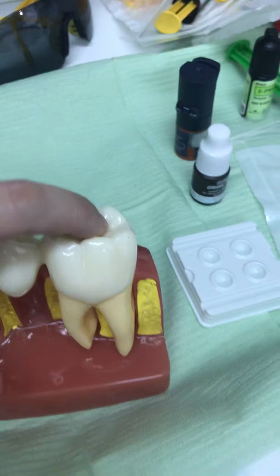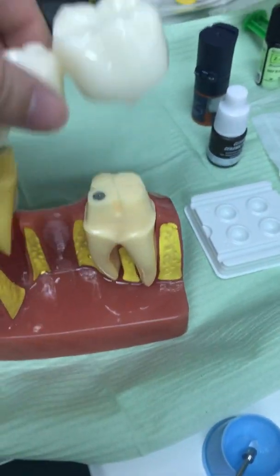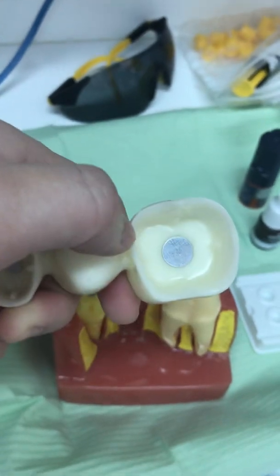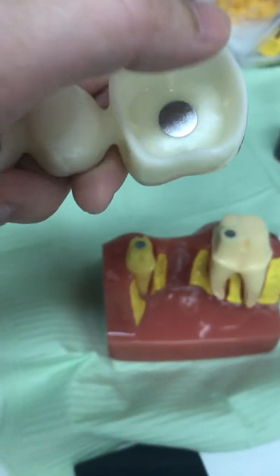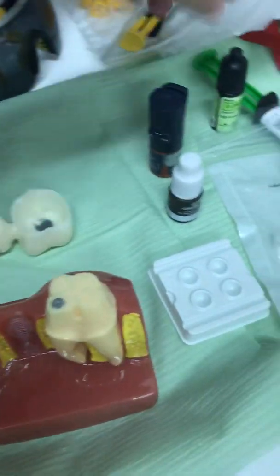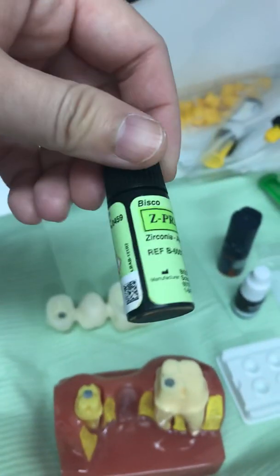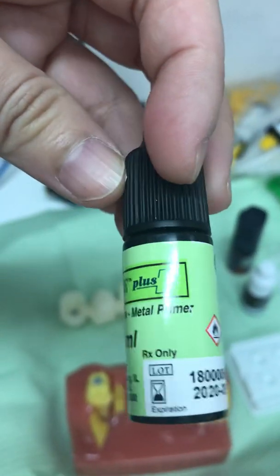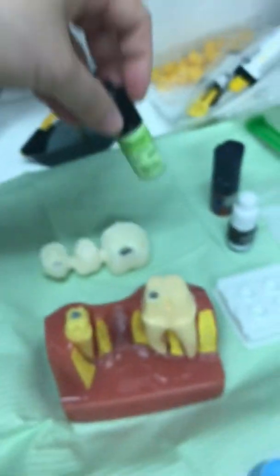Once the fit is confirmed, we take the crown out and will either sandblast the inside, or if it is not very dirty, we wash it instead.